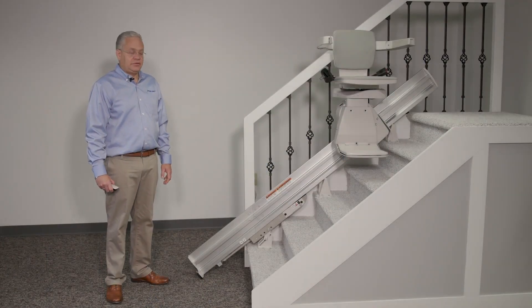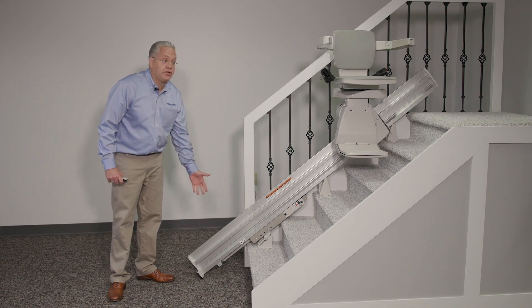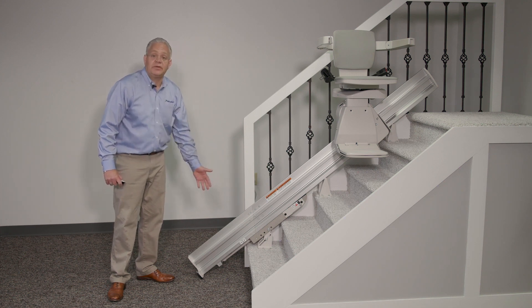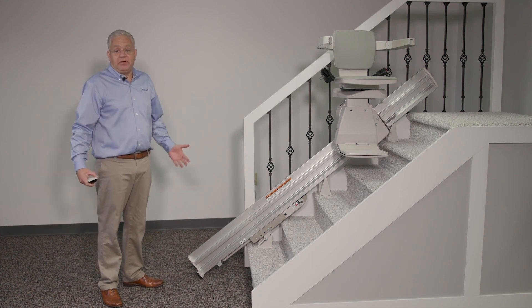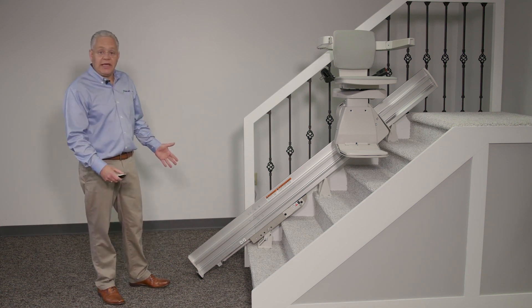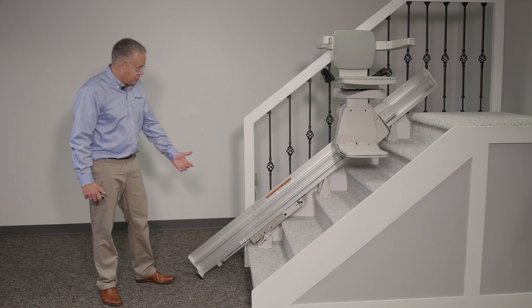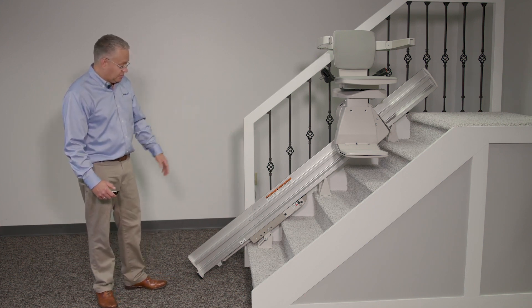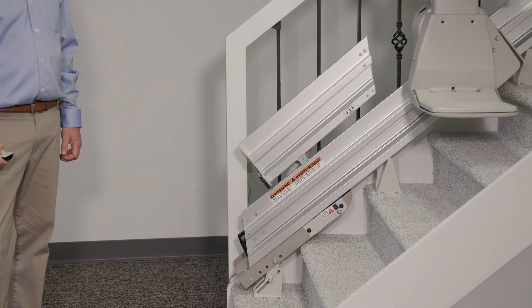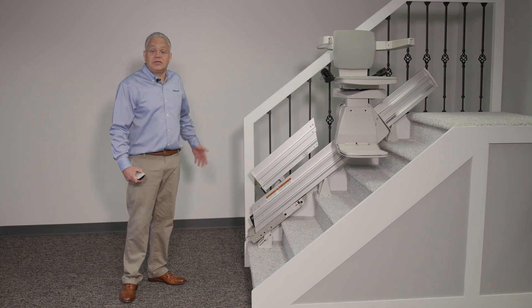One more consideration on Bruno stair lifts, or any stair lift in your home, is the rail obstruction at the bottom of the staircase. As the rail gets installed, as you can see, it protrudes a little bit past the end of the first step. In some homes, it's imperative to get that rail out of the way — maybe you have a doorway or a closet door at the bottom causing a blockage. We have options available, either a power folding or a manual folding rail. Today I'll show you the power folding rail, where you press a button and the rail folds to clear the space at the bottom of the staircase for any movement or access.